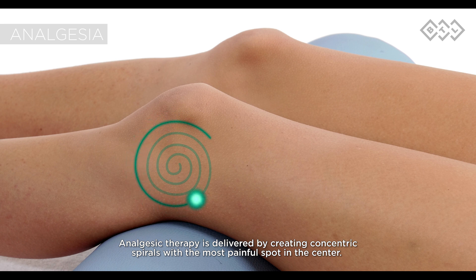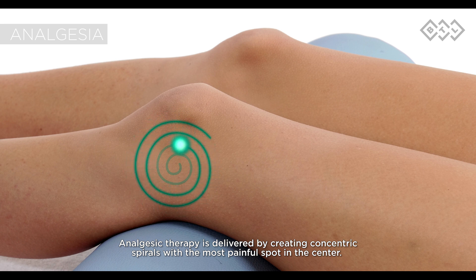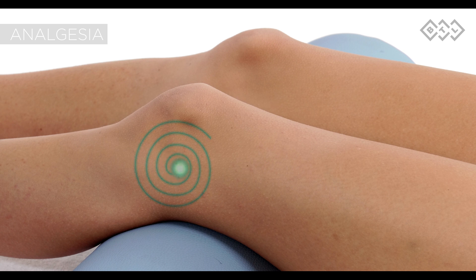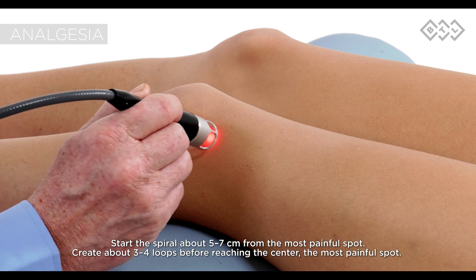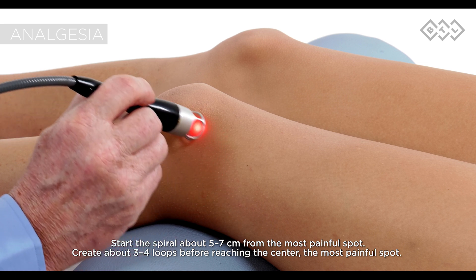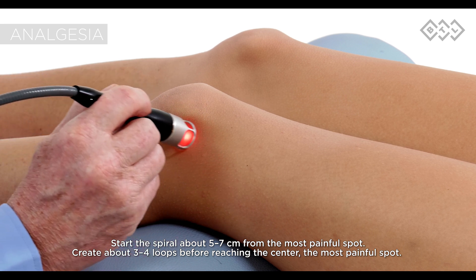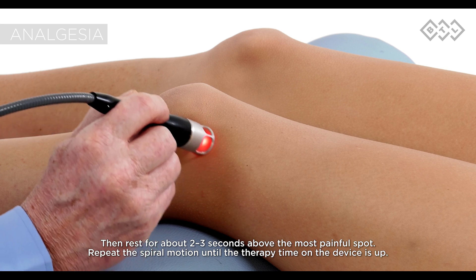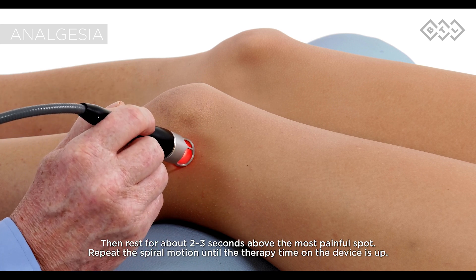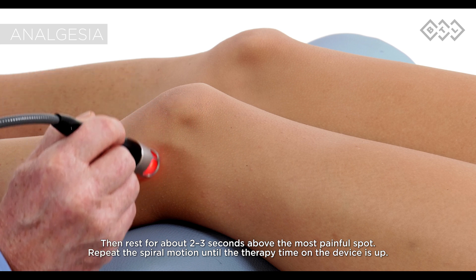Analgesic therapy is delivered by creating concentric spirals with the most painful spot in the centre. Start the spiral about five to seven centimetres from the most painful spot. Create about three to four loops before reaching the centre — the most painful spot. Then rest for about two to three seconds above the most painful spot. Repeat the spiral motion until the therapy time on the device is up.